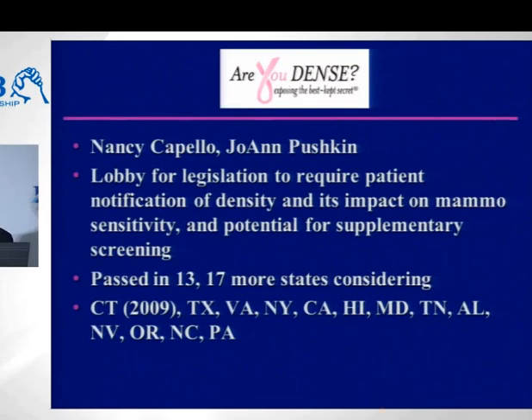Now, you can't just put your head in the sand and say, I don't want to do screening breast ultrasound. It is coming to a state near you. The organization AreYouDense.org was started by Nancy Cappello, who's a bright woman who was diagnosed with breast cancer and told by her doctor that the reason it didn't show up on her most recent mammogram was because she had dense breasts. And she said, wait a minute, I have dense breasts and nobody's told me about that, and nobody's told me that maybe I could have had my cancer found sooner with ultrasound. So this is a grassroots organization that has effected quite a bit of change.